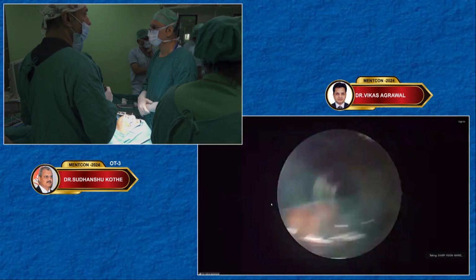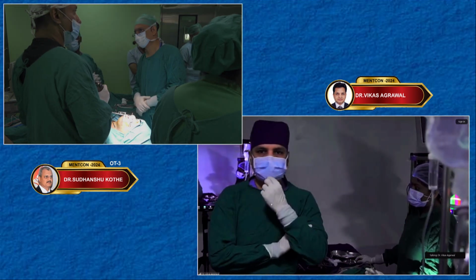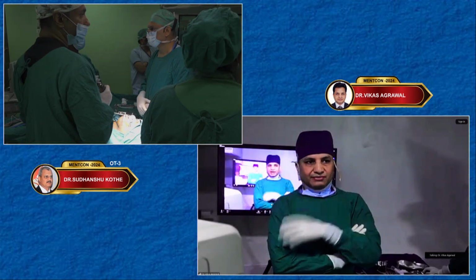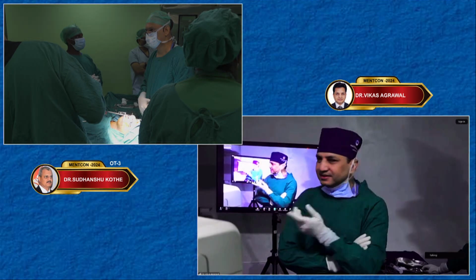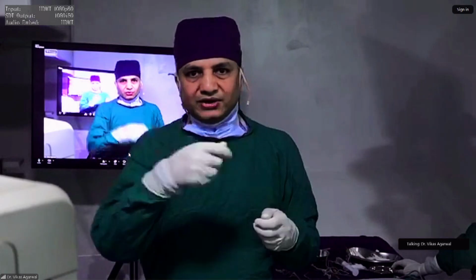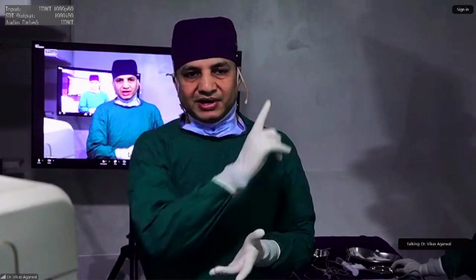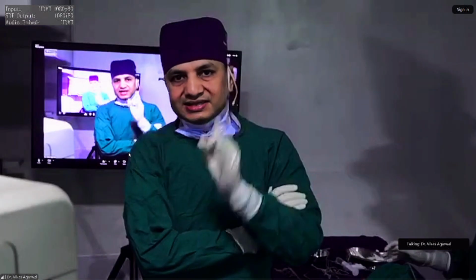All right. So external camera, please. I'll take my mask down with your permission, so that surgery is over. I'll take questions. And you saw how much the surgical time was, about 15 minutes? So it's not a very time-taking surgery. It's a wand-consuming surgery, so obviously you spend wand. If you do not want to do that, you can do it with a debrider, wait for the hemostasis, and then use the wand. But getting the final boundaries of the adenoids is very, very important. You can do a painless, bloodless, and recurrence-free surgery in every single case.